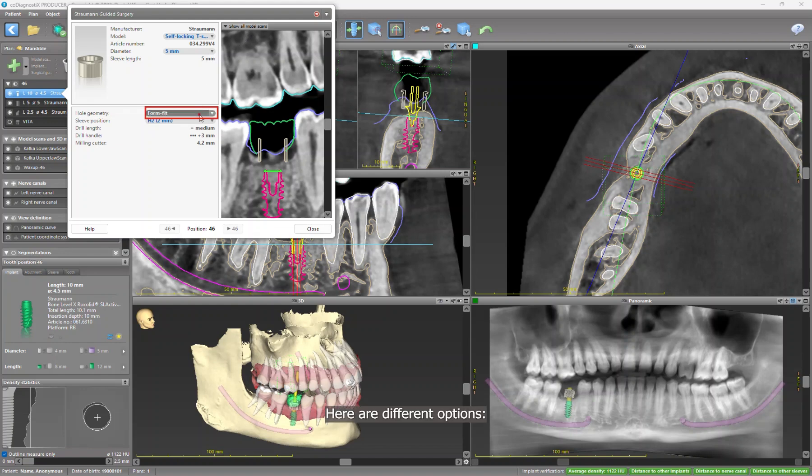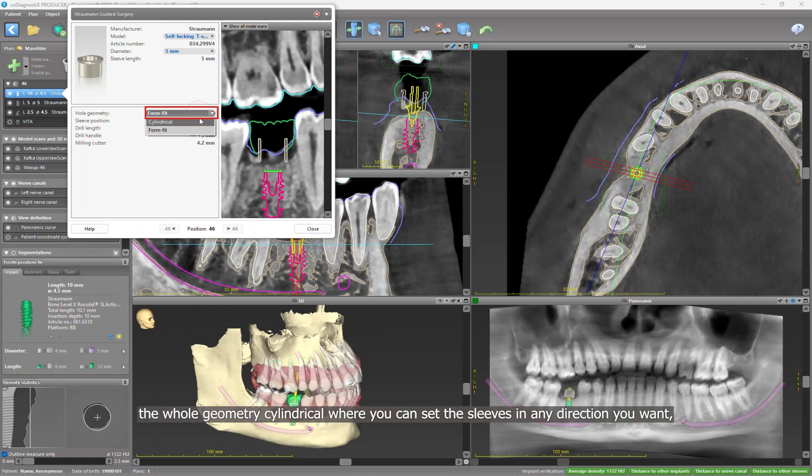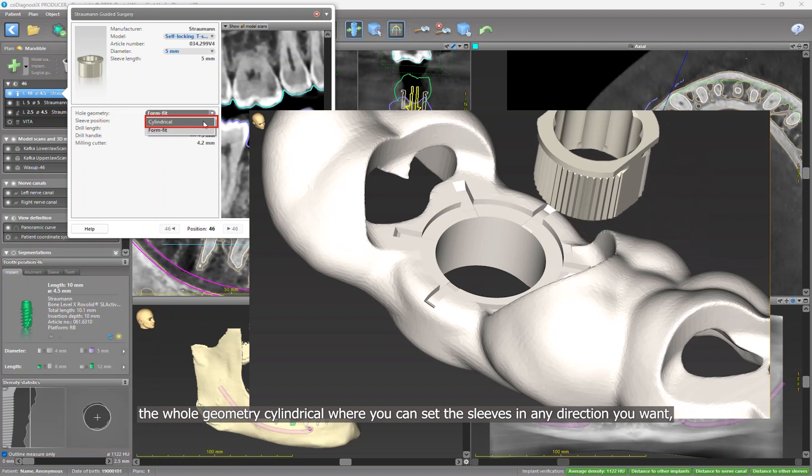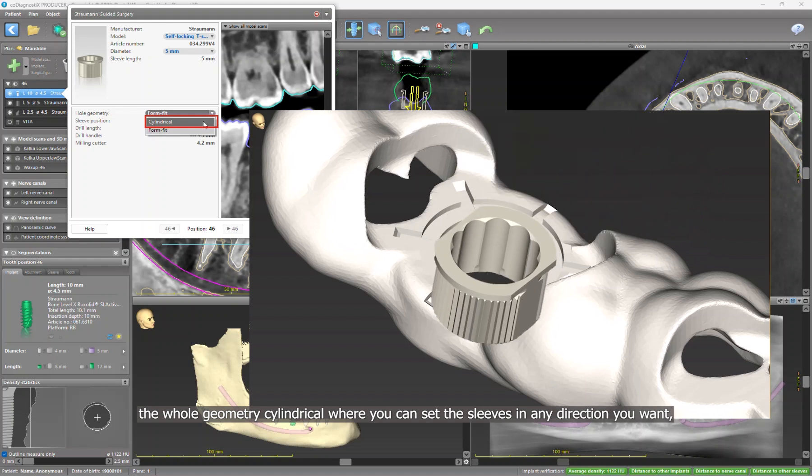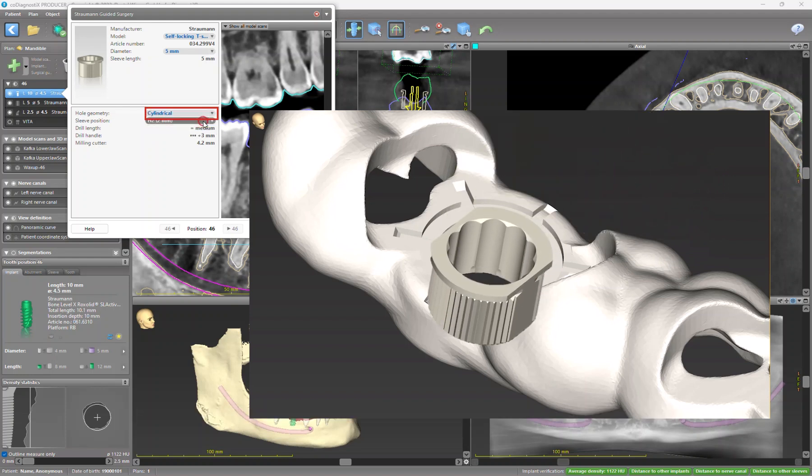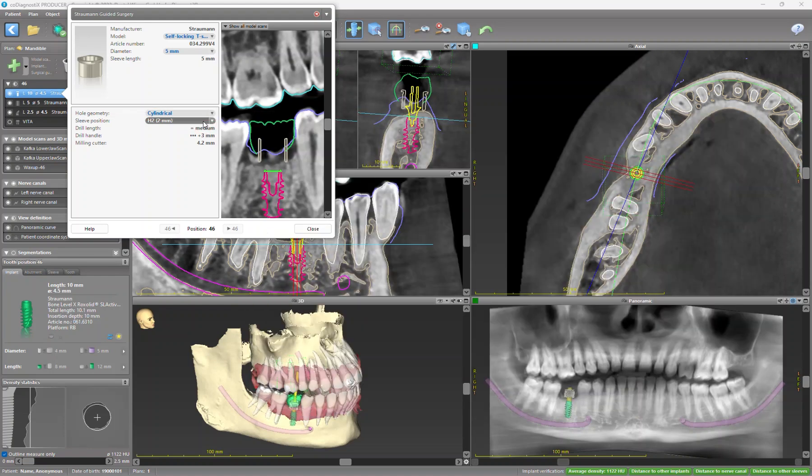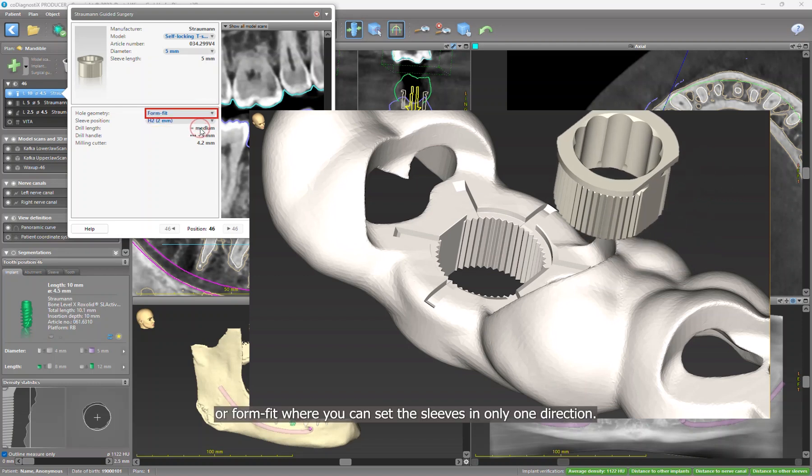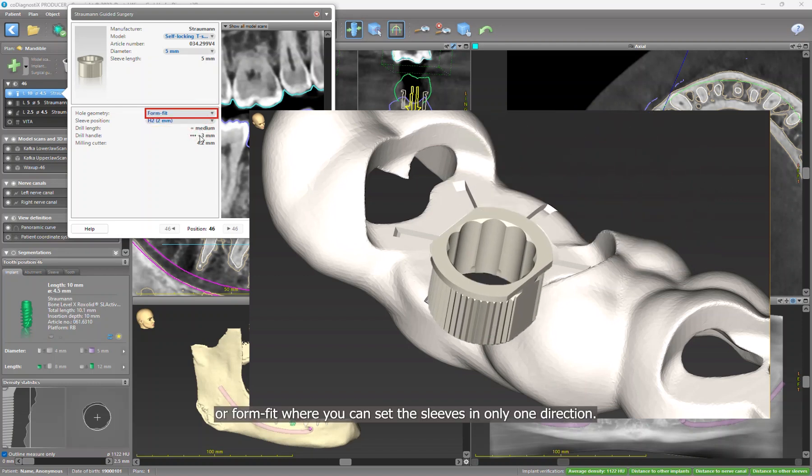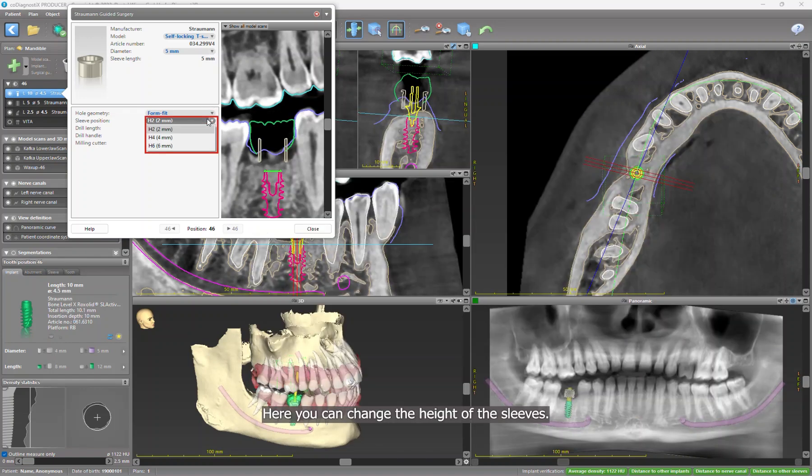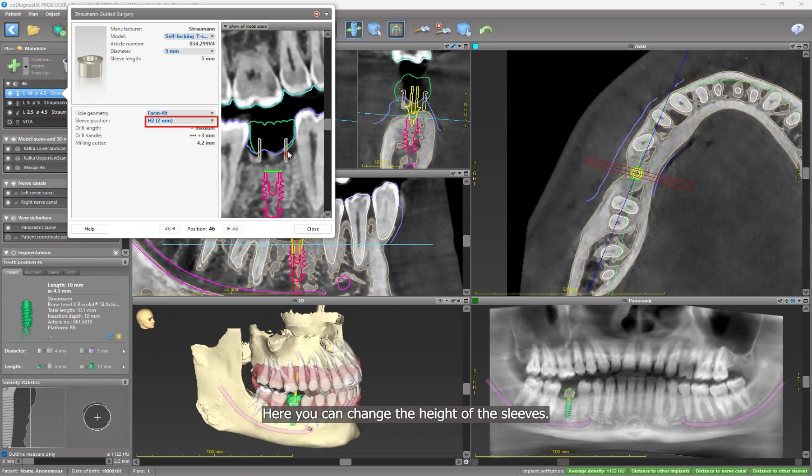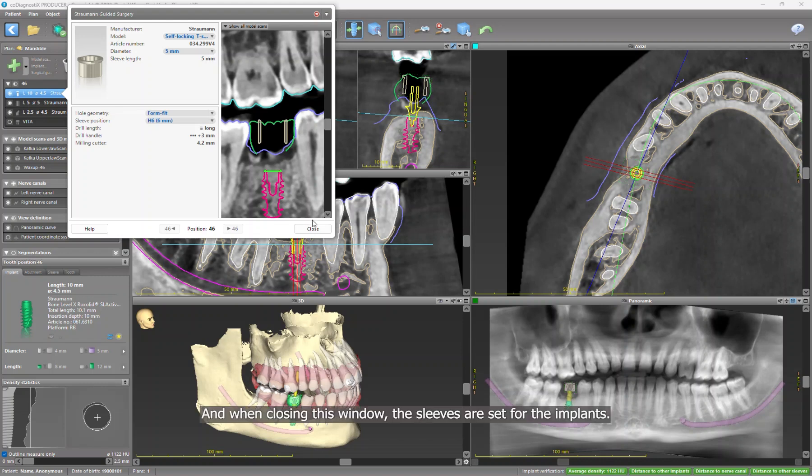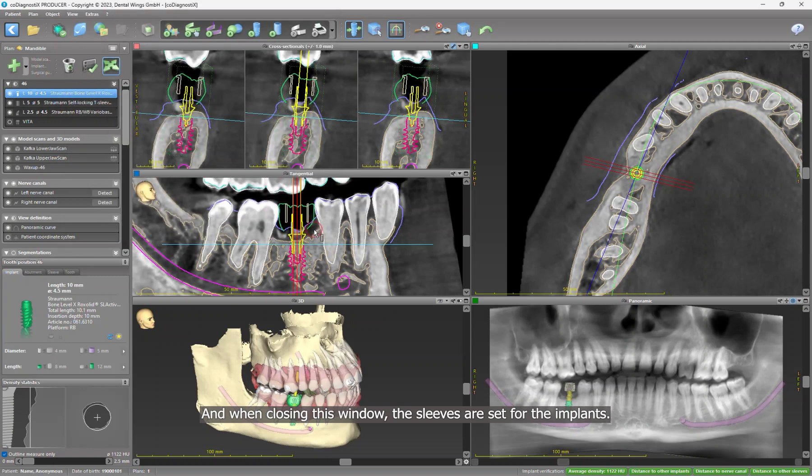Here are different options: the whole geometry cylindrical where you can set the sleeves in any direction you want, or form fit where you can get the sleeves in only one direction. Here you can change the height of the sleeves. Let's use H6.